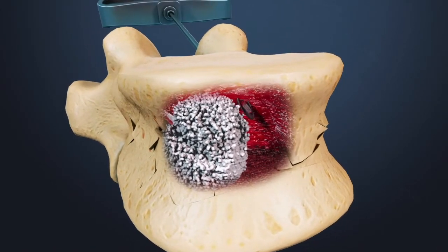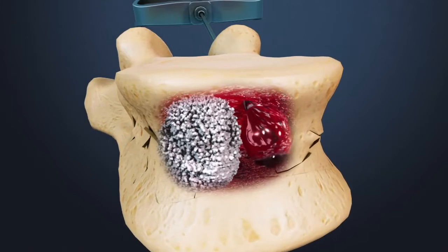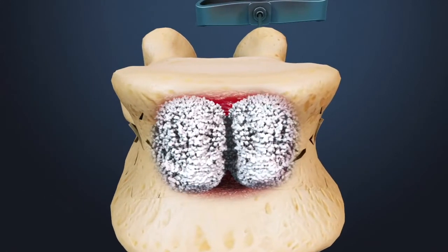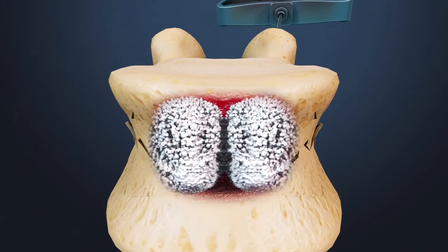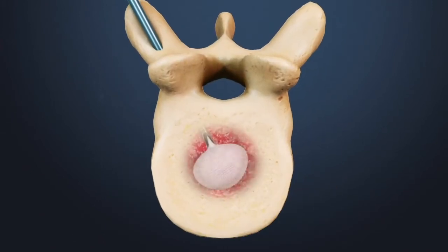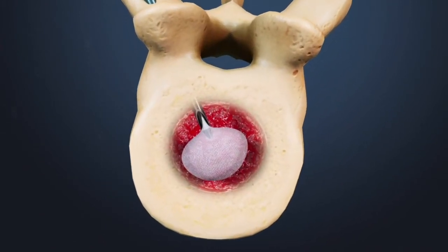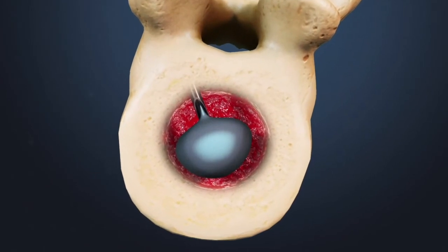The process may be repeated on the other side of the vertebral body to ensure uniformity and increase the chances of complete deformity correction. In other forms of kyphoplasty, other surgical approaches for creating the cavity may be used, such as a net or ball.